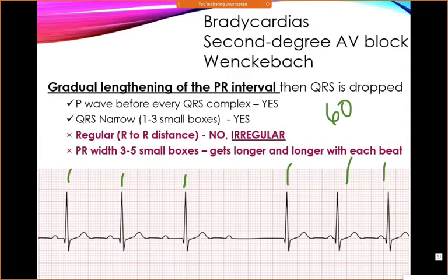Let's look at the PR interval. Is there a P before every QRS? There's a P, there's a P, there's a P. Something's missing here. I'm not really sure what's going on, so we're going to put a big question mark there. Technically there's a P before every QRS, so we're going to say yes. But that one's really, really long. There's something weird going on there, so let's go back and look at that.